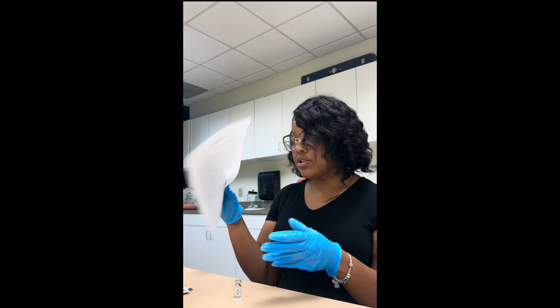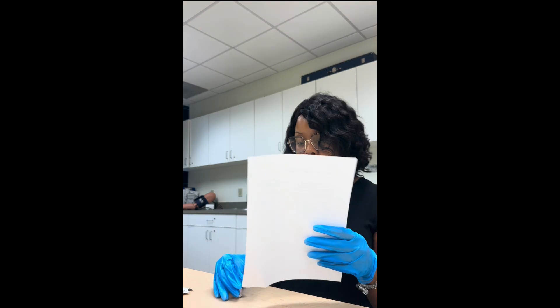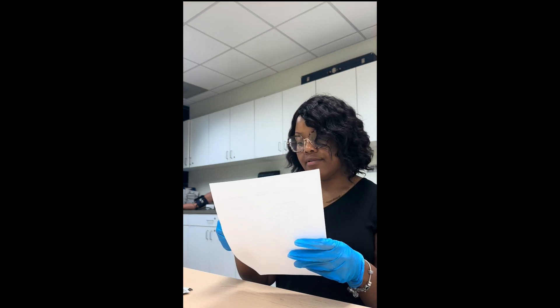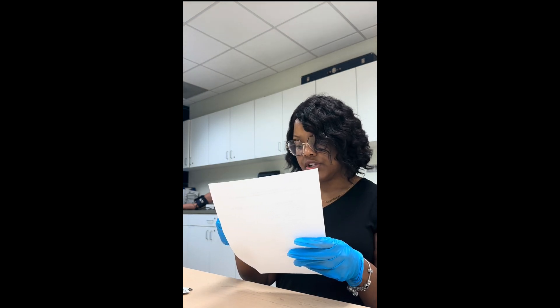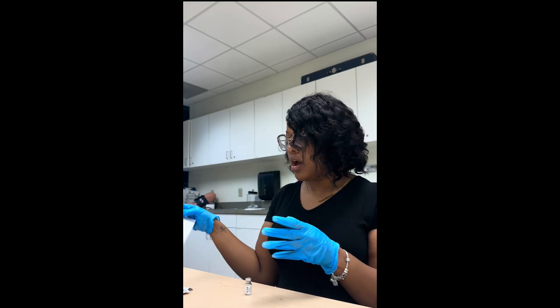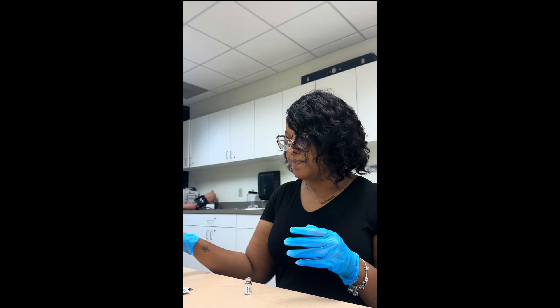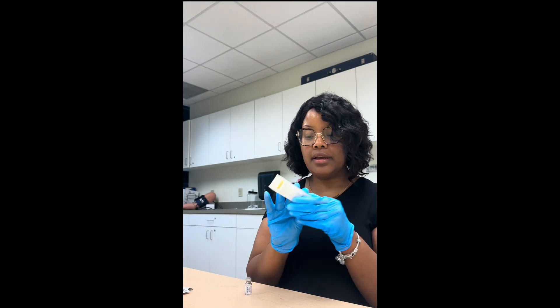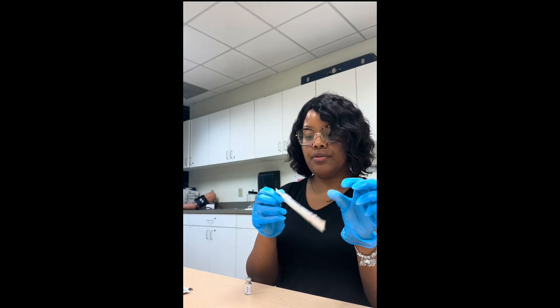I'm also going to look at the label one last time to make sure I have the correct medication — I'm going to give 0.1 ml. I'm going to use my tuberculin needle.